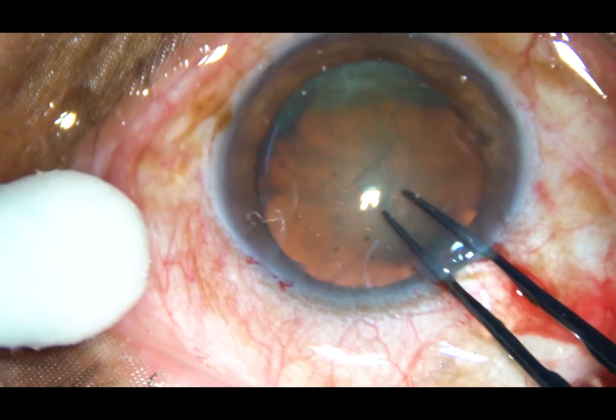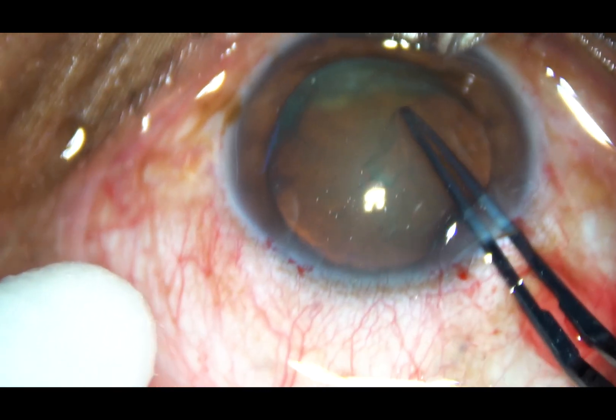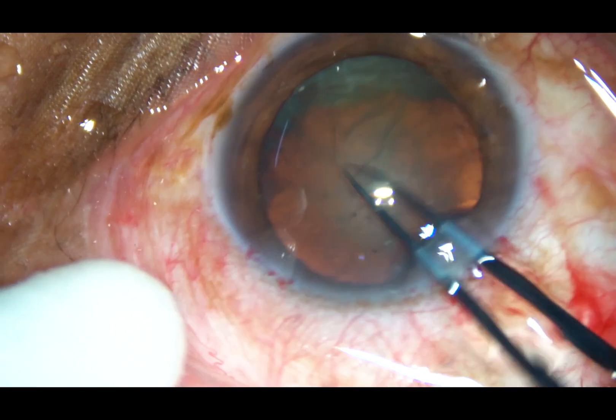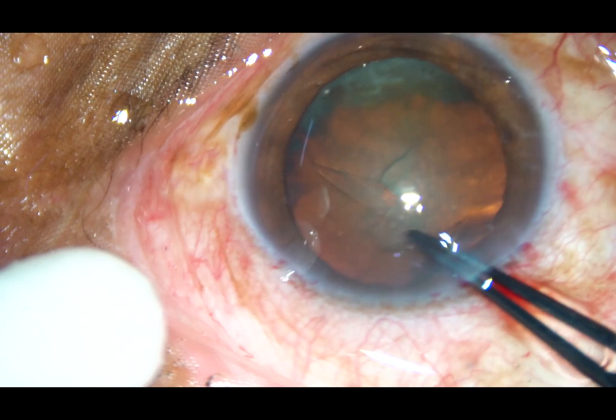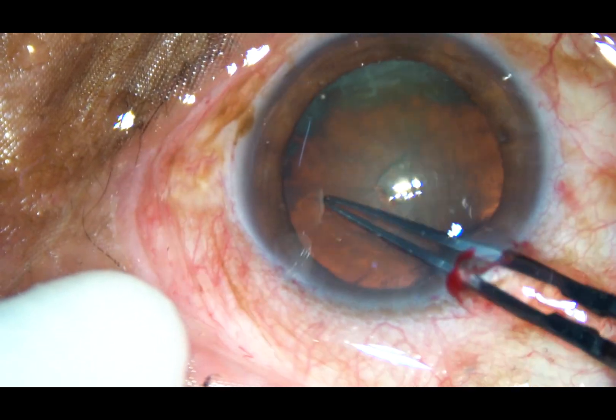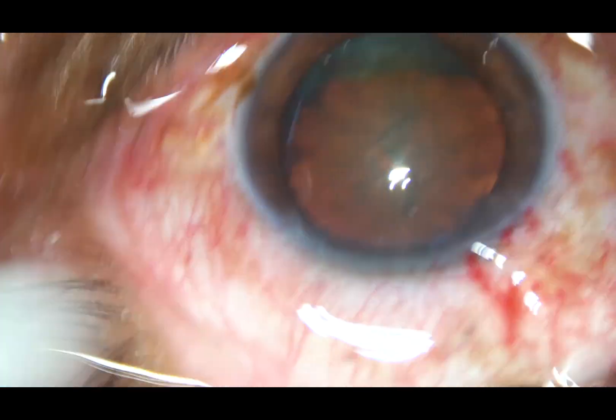The capsular tag is reached. This capsular tag is held with a Utrata forceps and with anti-clockwise movement, a continuous curvilinear capsulorhexis is being performed. The rhexis is done.